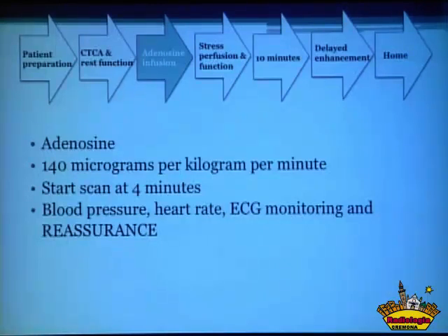During the infusion, we monitor their blood pressure, their heart rate, their ECG, and we do provide reassurance to the patient. Adenosine, as I'm sure many of you know, does make you feel particularly horrible. They're going to get breathless, chest pain, headache, nausea, and that sense of impending doom. But if they know that it's about to happen, if they know that that's really what we want to happen, because that's how we know the adenosine's working, and if they know that the moment we switch the medication off, they're going to go back to normal very quickly, most patients are very happy to go through it, and we haven't had anyone say stop, stop to us.